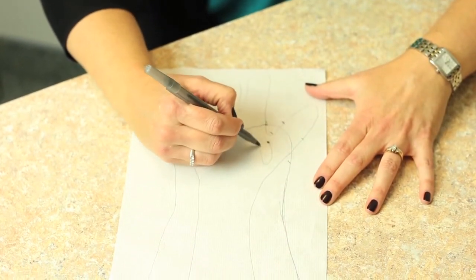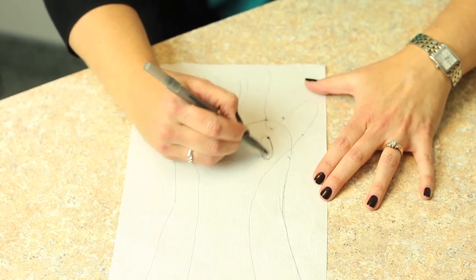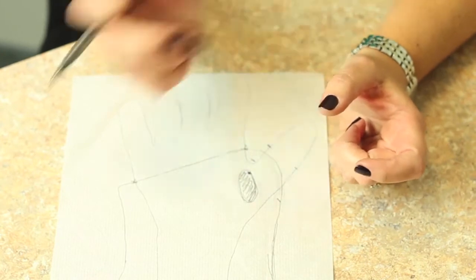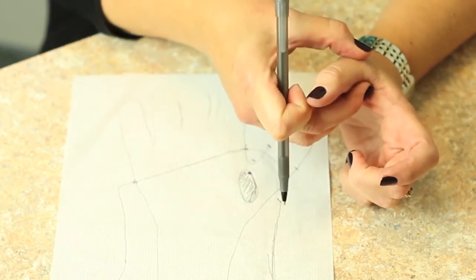We're going to bring that longitudinally. You never want to make this rounded, you want to make it oblong so that sits well on the inner area. If you make it rounded what happens is it tends to get caught at the MP joint level.